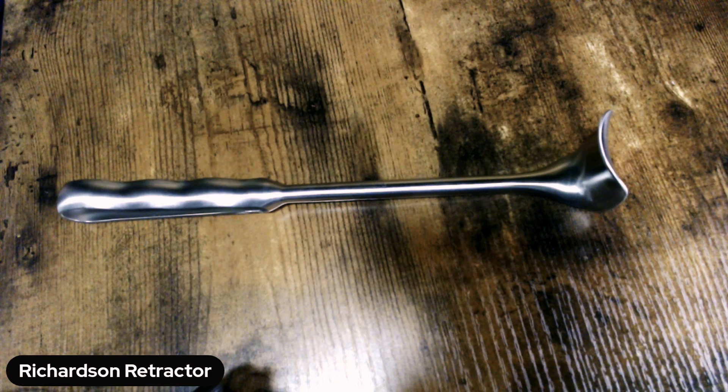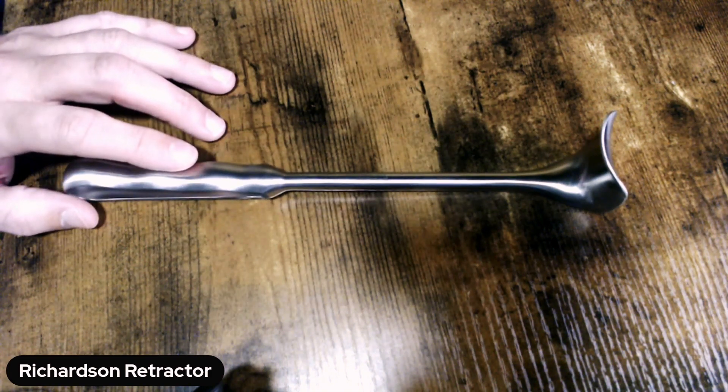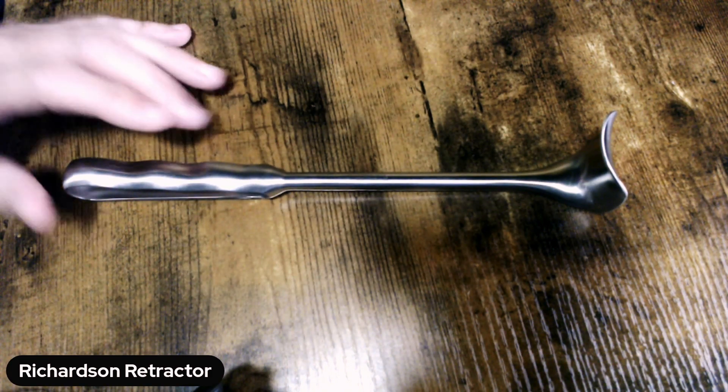Hello, my name is Richardson Retractor, and today we're going to talk about this unique retractor that you will almost always see in any sterile processing department around the globe. If you've got a general tray, you've got a Richardson Retractor in your tray. This particular unit here is nine and a half inches in overall length.